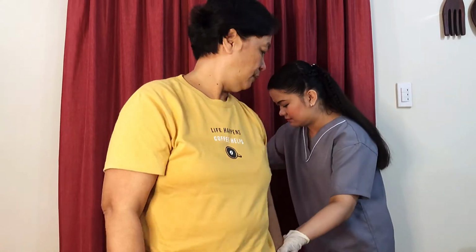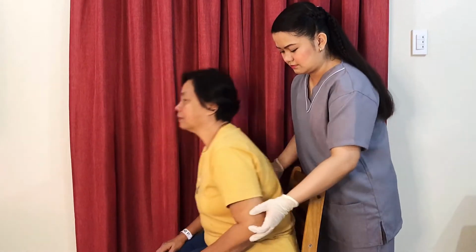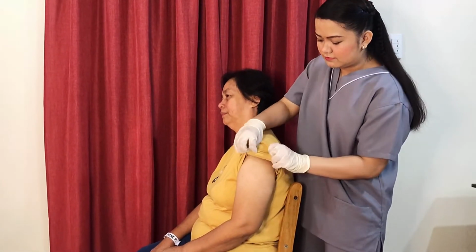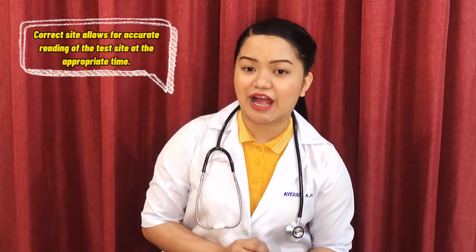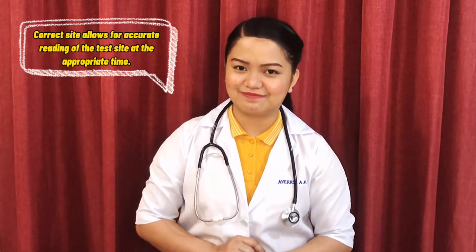And then select the appropriate site for administration. Assist the patient to the appropriate position as required. Site should be free from lesions, rashes, and moles. Choosing the correct site allows for accurate reading of the site at the appropriate time.